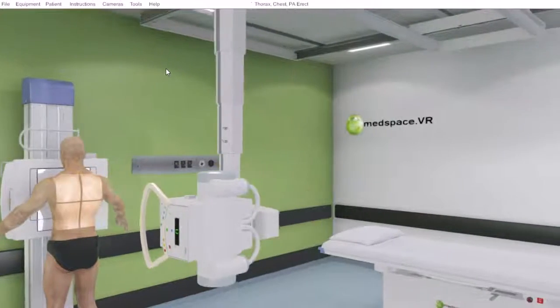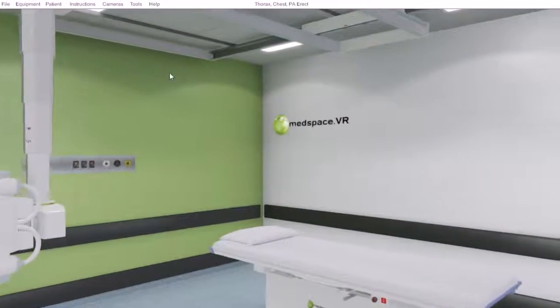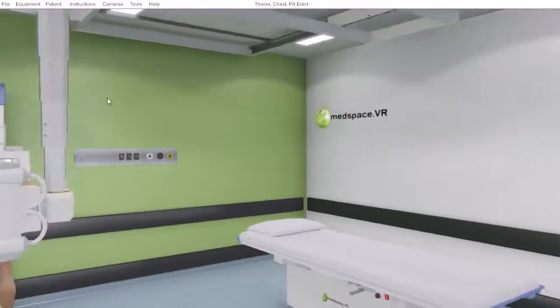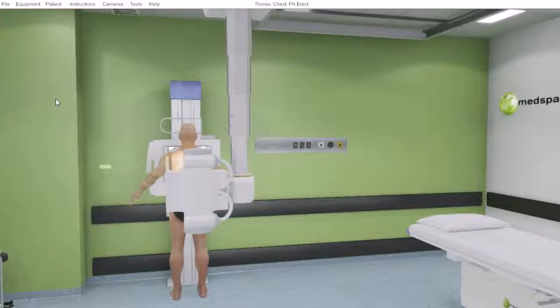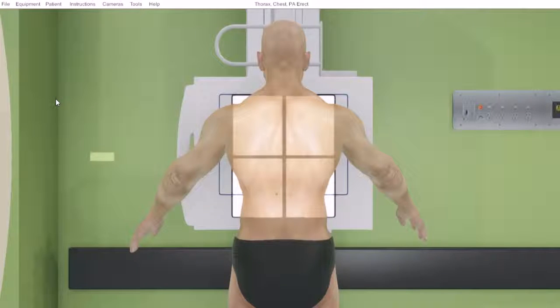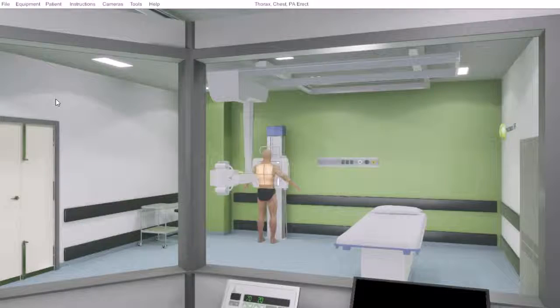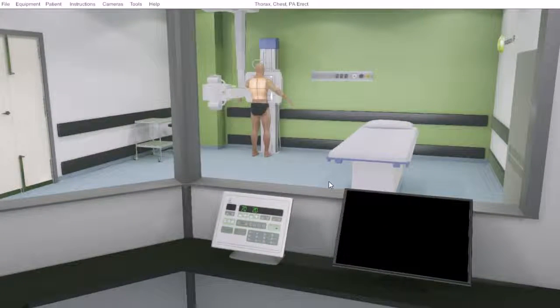As a radiographer we can walk around the room, look from different angles, look from the collimator, and jump to the control panel.